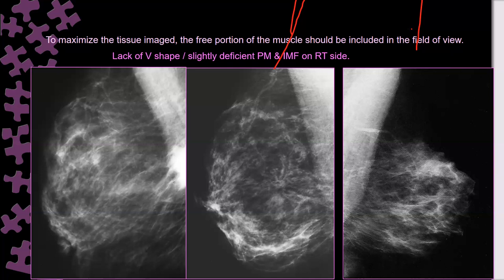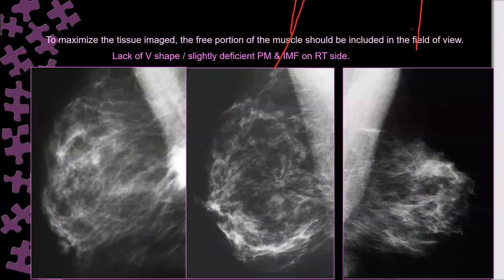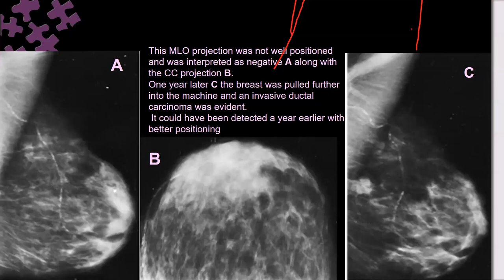The overexposure. Even the borders here are sharper than this. The apex is not clear in this area; they might take it as some distortion here and then repeat. I don't know exactly the reason, they did not explain. This explanation is mine. I did not find it. They said they just repeated the image and found this, without explanation.